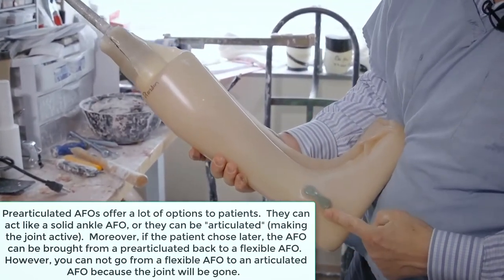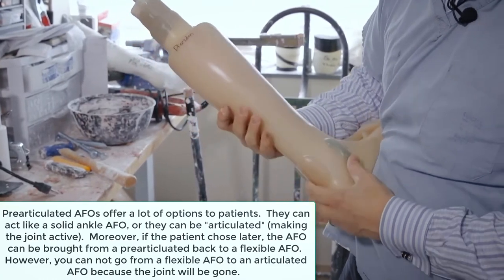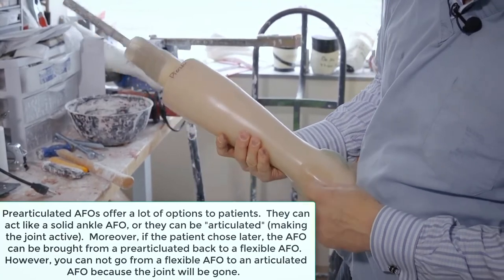And you can see this particular joint is in there. And that would be a pre-articulated. And this is the plantar flexion stop before we cut it, if we did cut it.